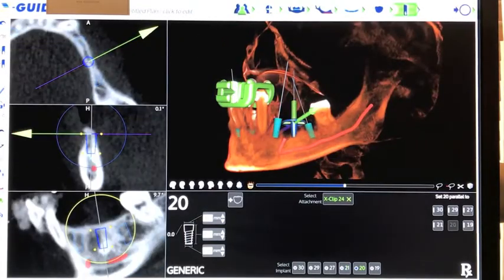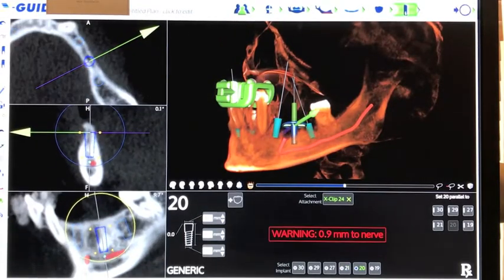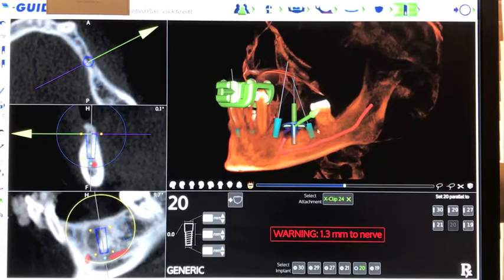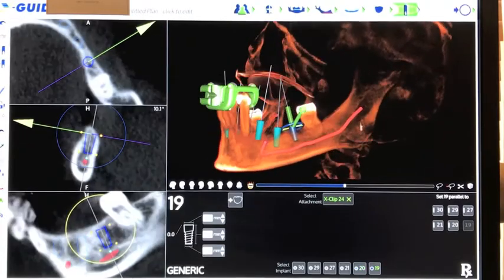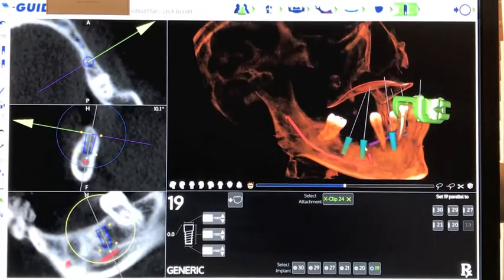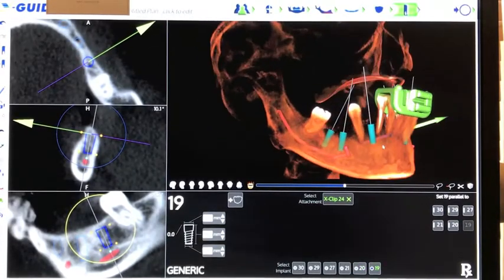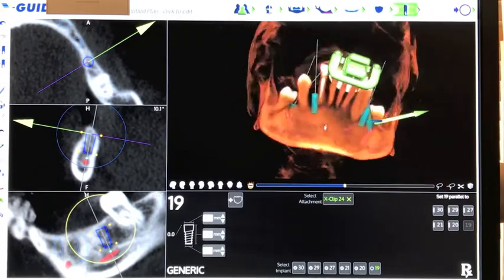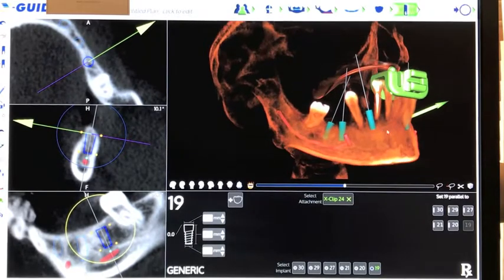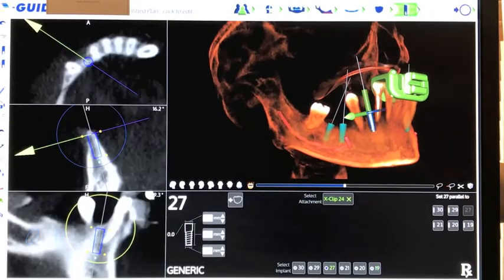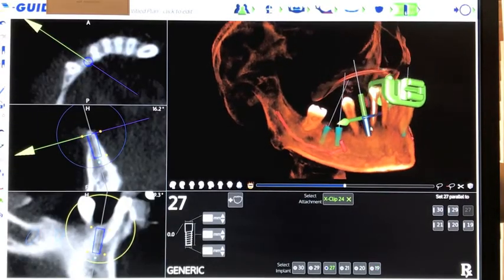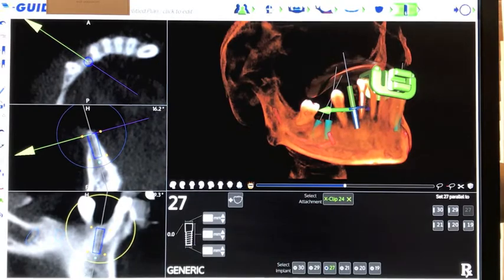Once the implants are virtually inserted, they are carefully positioned. The exact diameter and length of each implant is determined, as well as its exact placement with regards to the depth in the bone, location on the ridge, and angulation.